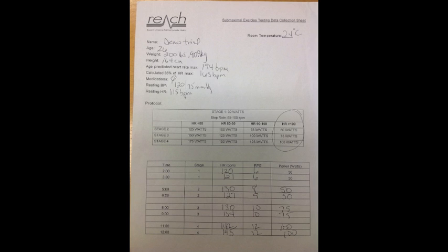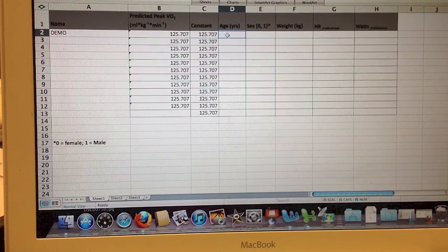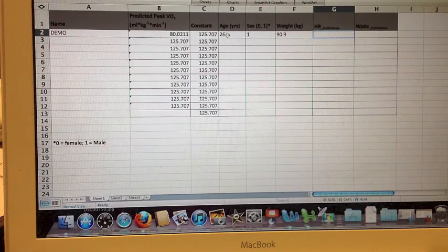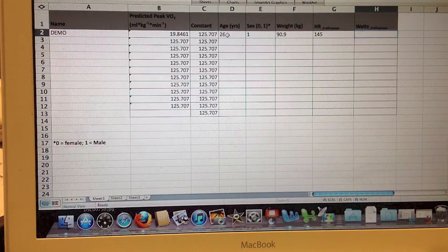Here is the completed exercise test for the individual in the demonstration. Once you've completed the Submaximal Exercise Test, you can transfer the data from the data sheet into an Excel spreadsheet. This individual was 26 years of age. You need to add in either a zero for female or one for male — this individual was male, so we'll enter a one. Then enter their weight in kilograms. Next, add in the heart rate that was the last one recorded; for this individual it was 145. Then add in the watts — whatever the workload was at the end of the Submax Test. In this case it was 100. We come up with an estimated VO2 peak of 37.7 milliliters per kilogram per minute.